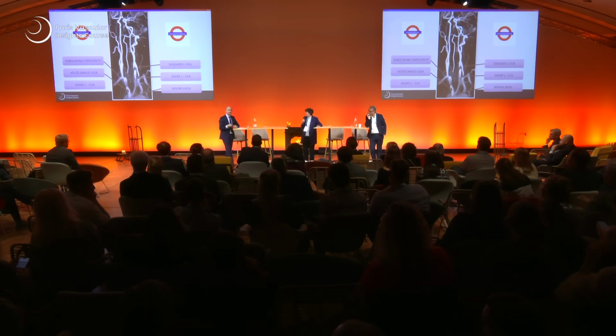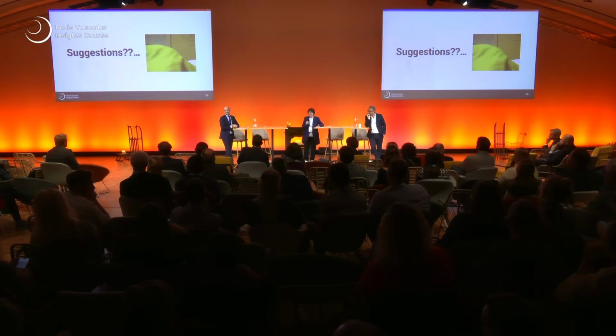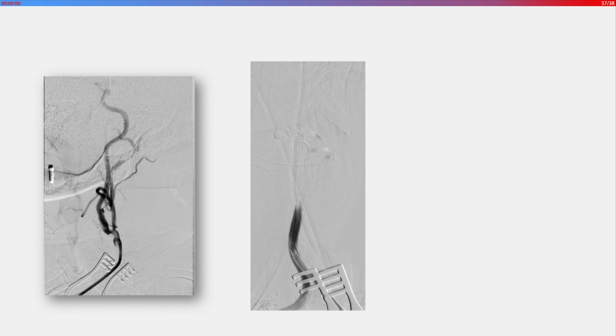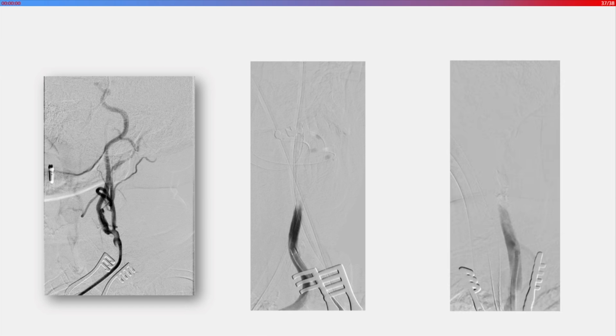So what did you do? TCAR. We did it. We pushed the limits. This is the first picture. Second picture. I guess we do not have the 5 centimeters. We don't have that before. So this is only TCAR for experienced hands.